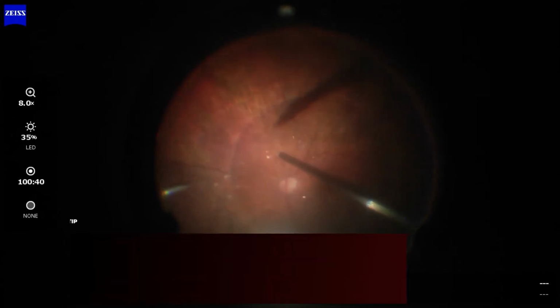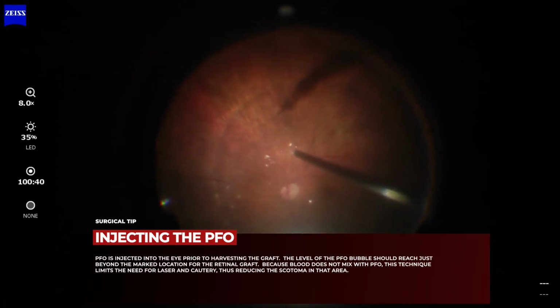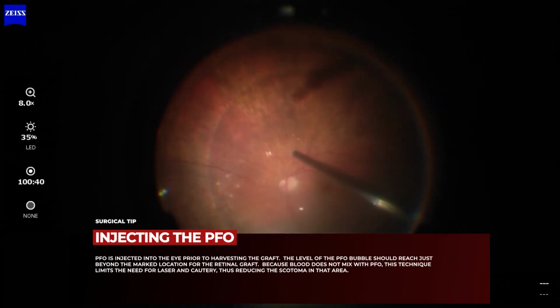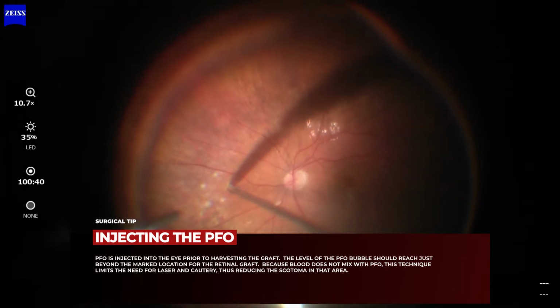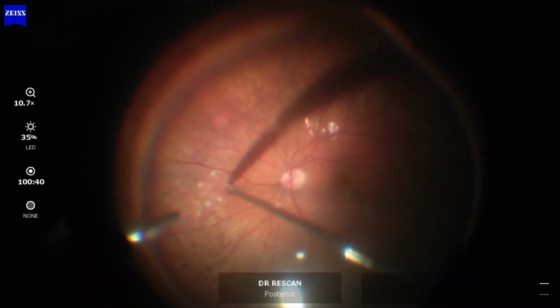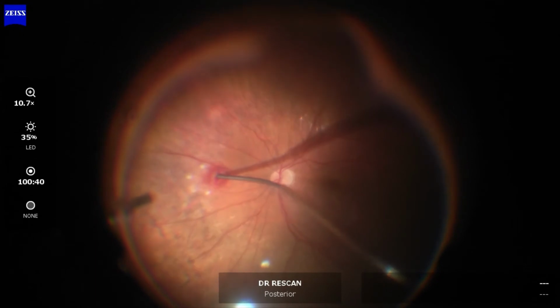PFO is injected into the eye prior to harvesting the graft. The level of the PFO bubble should reach just beyond the marked location for the retinal graft. Because blood does not mix with PFO, this technique limits the need for laser and cautery, thus reducing the scotoma in that area. The viscodissector is used to inject visco to elevate the side of the retinal graft.